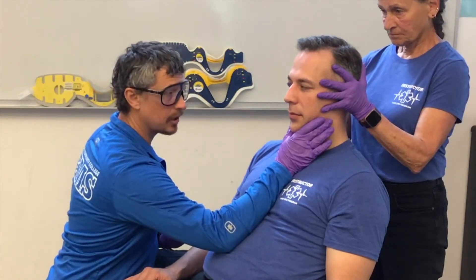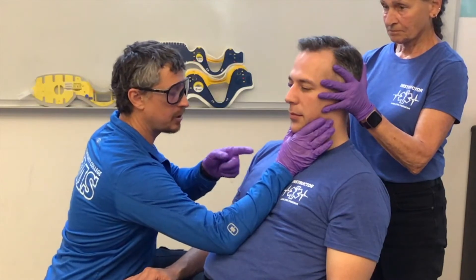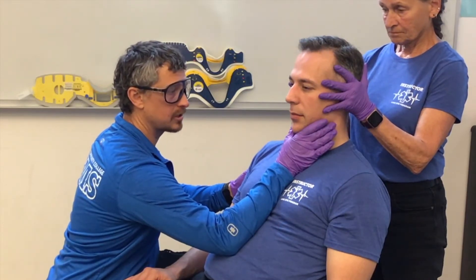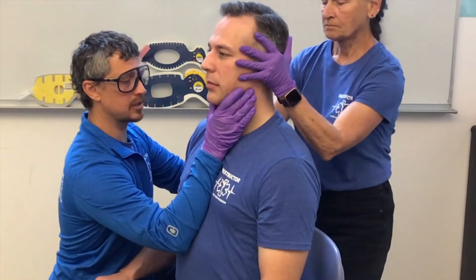Then I'll talk to my patient Nathan: 'When I tell you to, I'm going to have you pivot at your hips, keeping your back straight, pressing against my forearm, and we're going to help you sit up straight. Any questions?' Go ahead and sit up nice and tall, sit up nice and straight.